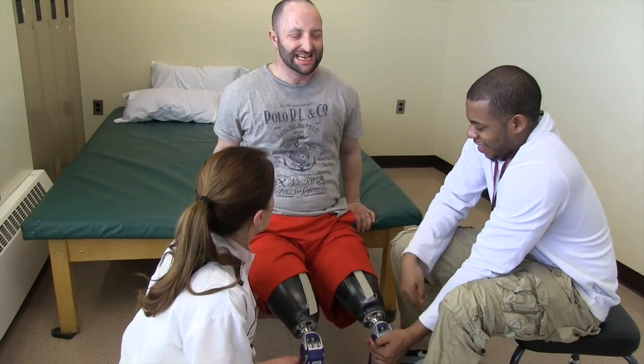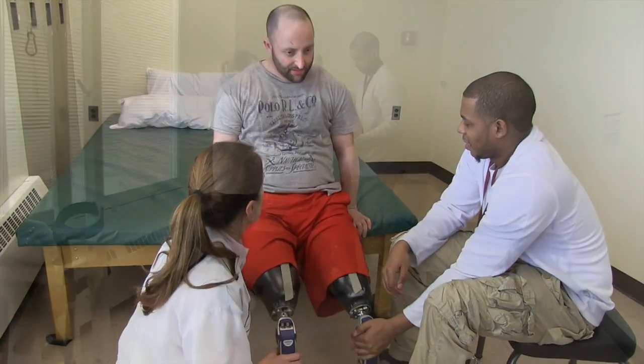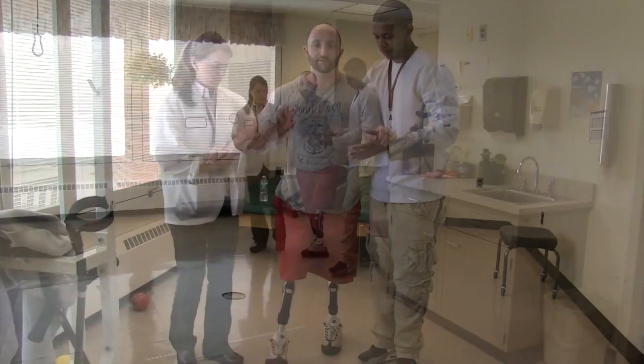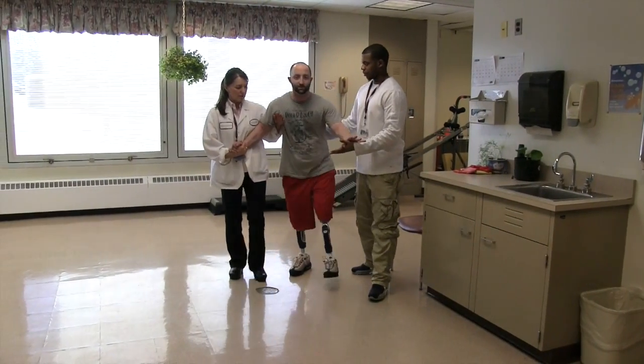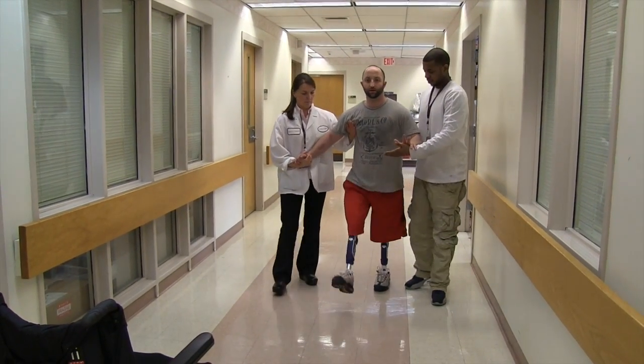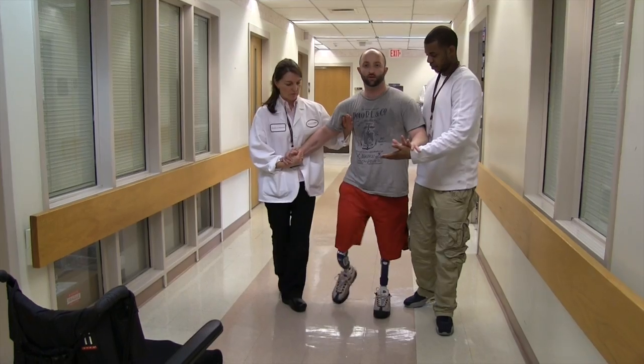That's great. Nine. And pull yourself up. Ten. Look it up. Left. Left. Forward. Heel. And come to the chair.